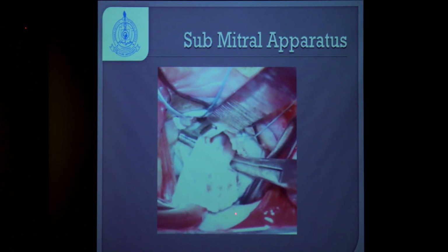This is another important technique that we follow in our institute when we have to excise the chordae. Please remember, this is the red zone and this is the white zone. No matter where we are, no matter what we do, we have to be in the white zone, because entering the red zone can be detrimental both for the patient and for the surgeon. These are the chordae tendineae. We use a right angle forceps and cut on the white zone so as to not injure the deeper structures or the papillary muscles.